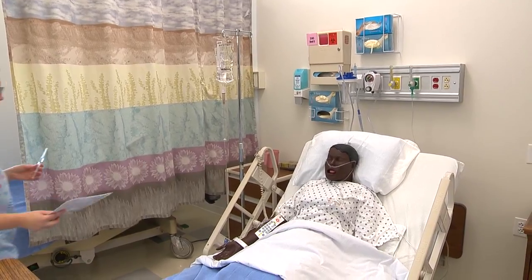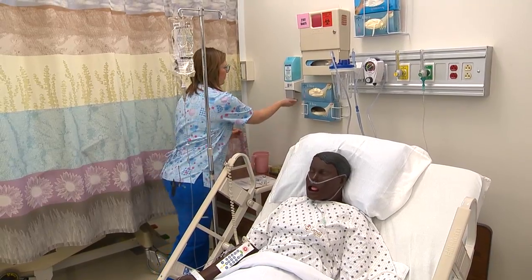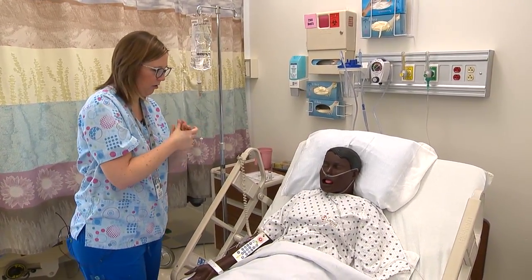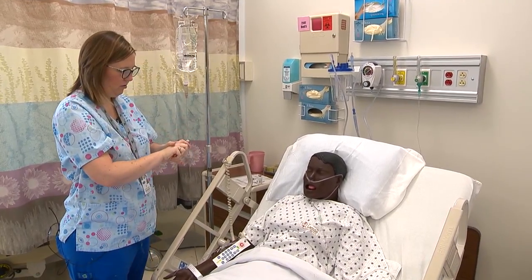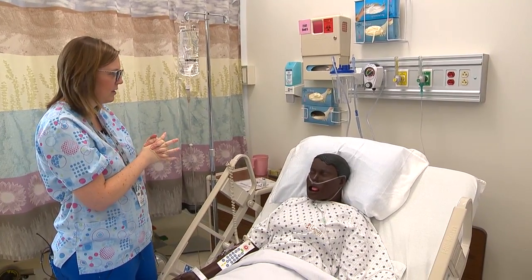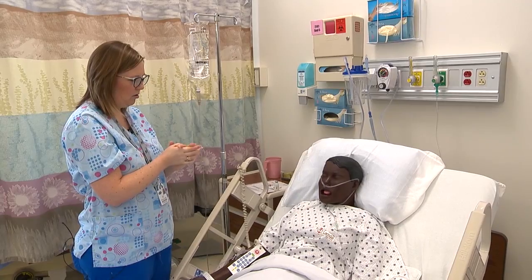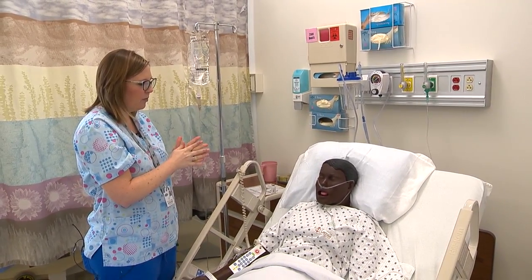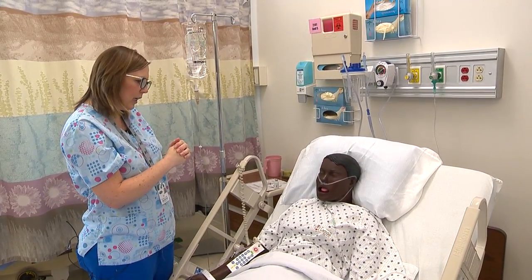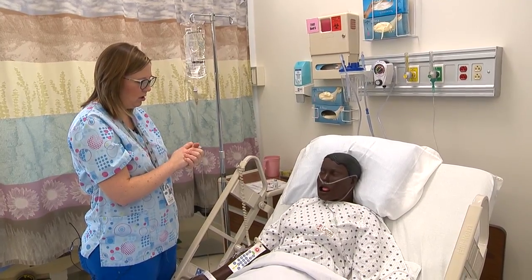Hi Morgan, it's Sarah, your nurse. I'm here with your pain medication. Where are you experiencing pain right now? [Patient: Just in my chest.] Can you tell me what your pain is on a scale of 0 to 10? [Patient: It's about a 7 right now.] How would you describe the pain — is it nagging, stabbing, gnawing, aching, cramping? [Patient: It's crampy and consistent. It just doesn't go away.]